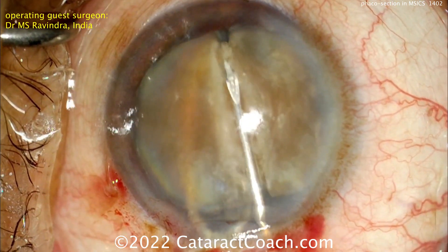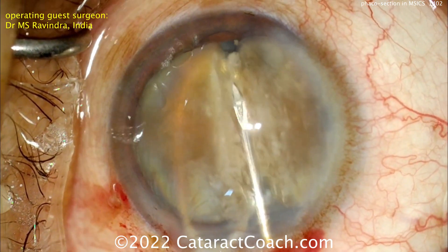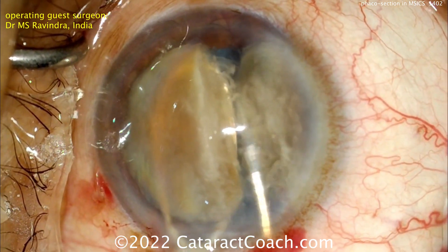You'll be able to bisect the nucleus completely. This is obviously a very safe technique — the eye is full of viscoelastic, the anterior chamber is nice and deep, the endothelium has been protected. And there you go — look at those two separated halves.